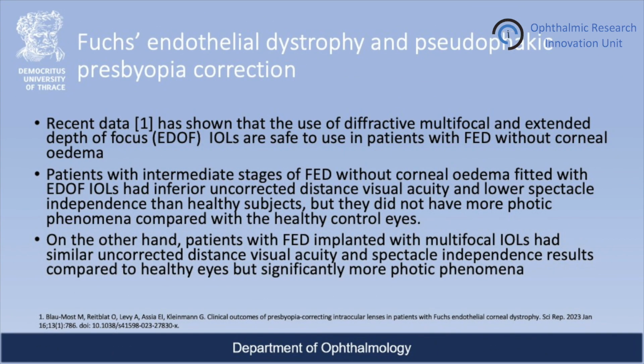In more detail, recent data has shown that the use of diffractive multifocal and extended depth of focus intraocular lenses are safe to use in patients with Fuchs' endothelial dystrophy without corneal edema. Patients with intermediate stages of Fuchs' endothelial dystrophy without corneal edema fitted with extended depth of focus intraocular lenses had inferior uncorrected distance visual acuity and lower spectacle independence than healthy subjects, but they did not have more photic phenomena compared with the healthy control eyes.